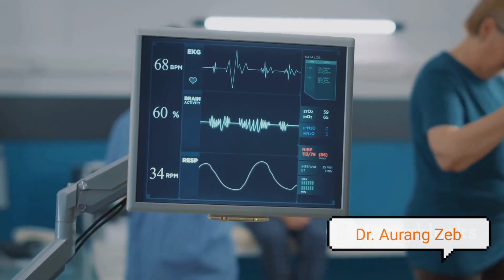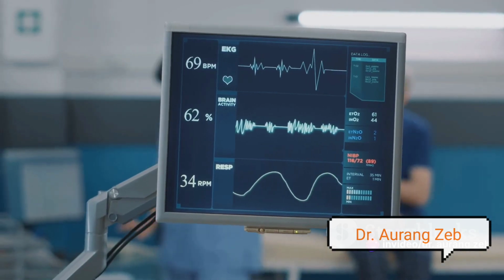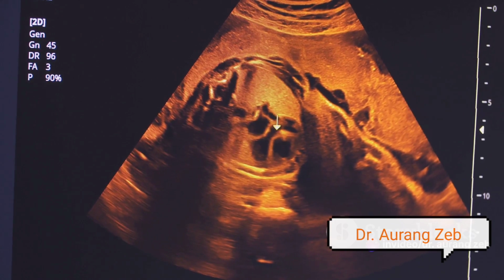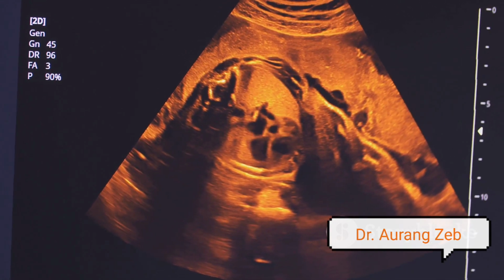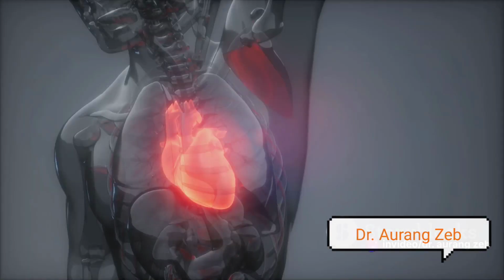Now, let's talk about the parameters to record. In each of these views, we measure the sizes of the chambers and the thickness of the walls. We also evaluate the motion of the valves and the septa. These measurements give us information about the heart's structure. We can detect abnormalities like enlarged chambers, thickened walls, or defective valves.